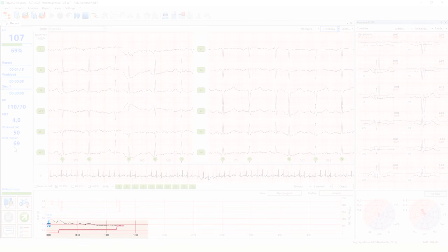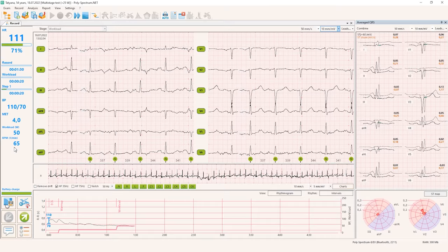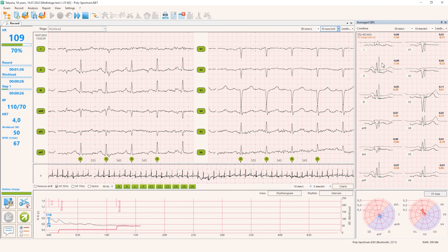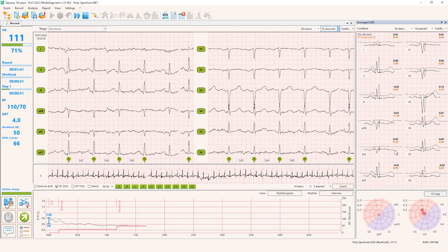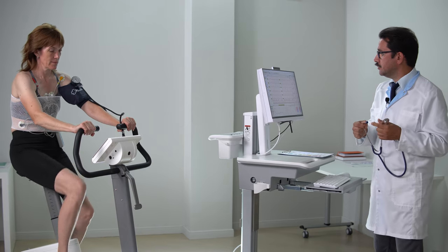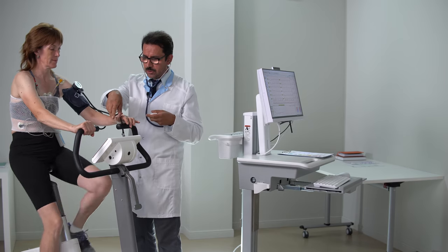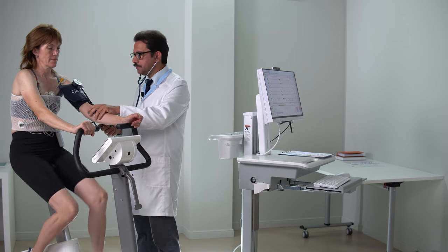The exercise will be going up in 25-watt steps every 2 minutes. What should I do during this 2-minute period? For sure, I need to check the ECG. I can check the native 12-lead ECG, and also I can check average QRS complexes to see the signs of ischemia like ST depression. In the second minute of every stage, I need to measure blood pressure. Pay attention that it's not an immediate procedure. You need time to perform the measurement and to come back.